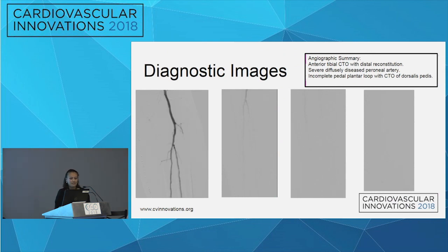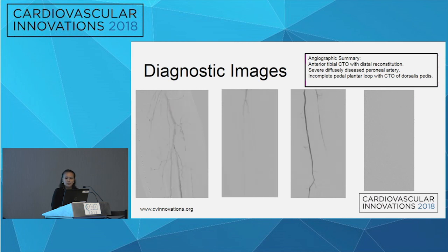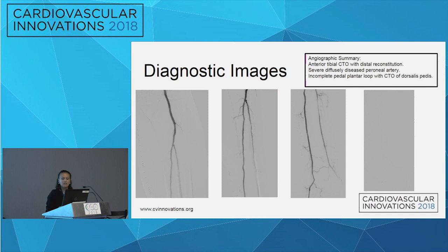These are our diagnostic images. On the image on the left, we see CTO of the anterior tibial with distal reconstitution of flow. We have a severely diffusely diseased peroneal artery. And in the far picture on the right, you see an incomplete plantar loop with CTO of the dorsalis pedis.